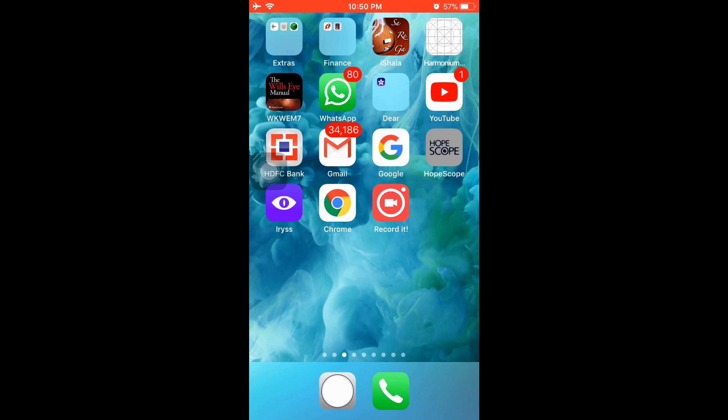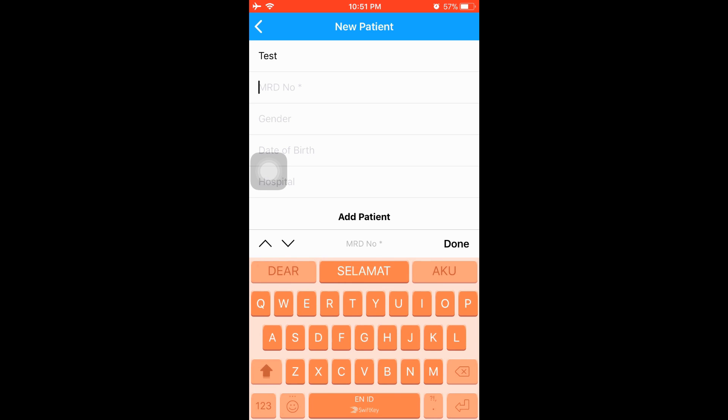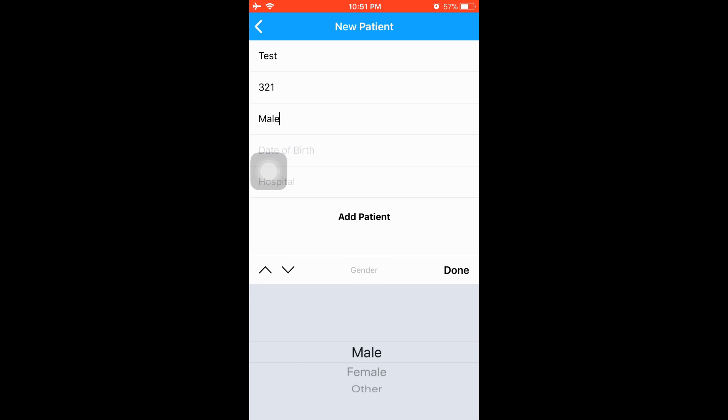This is the iOS app and it has almost the same functionality as the Android app.